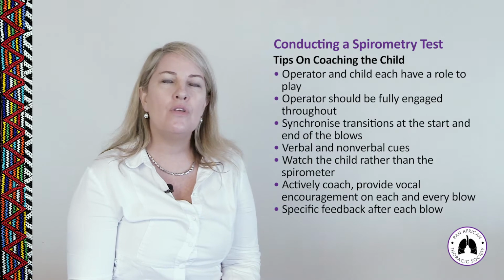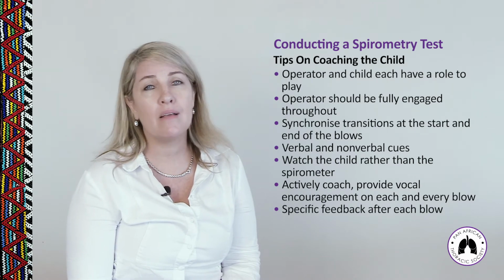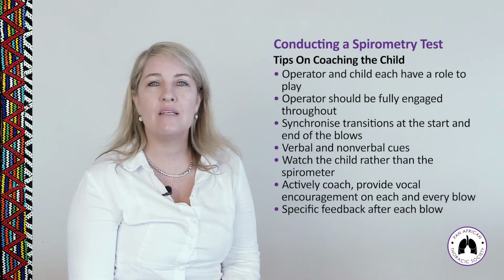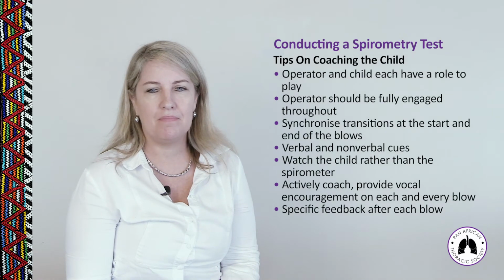You need to use incentive graphics if you can. That's pictures that the child can look at on the screen. They love to blow out the candles or blow bricks out of a wall or whatever the incentive graphic is on the spirometer that you've got. Put that on for the children. They love it. Even the adults love it.